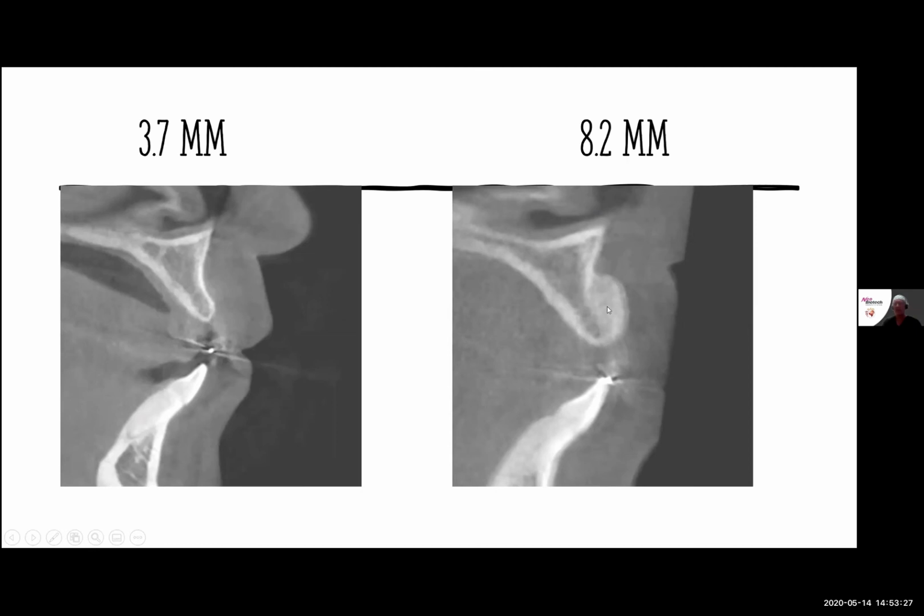It is so much easier to be able to angle an anterior implant and put it where you want it to be so that the tip of your implant is going to come out the incisal edge of your adjacent teeth rather than trying to place it completely to the lingual because you don't have any facial bone that's there. In looking at placing an implant here, yeah, you could probably place a little mini here, but the angle of that is going to be hard and awkward, and you're not going to be able to have an ideal position of that. Growing bone first and then placing the implant where you want it is the way that I'm suggesting that this can be done.